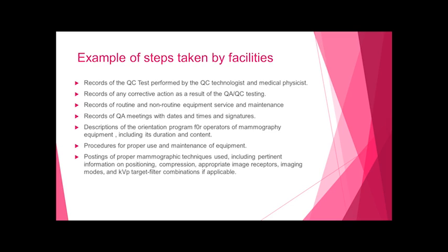Descriptions of the orientation program for operators of mammography equipment, including its duration and content. Say you gave a class on how to operate the equipment. Like, if you have too long of a time of exposure, what are you going to change? You would change to auto time and bump up the KVP, things like this that you taught your personnel.